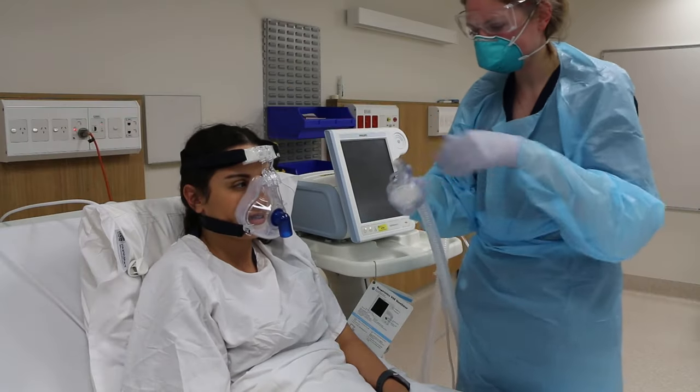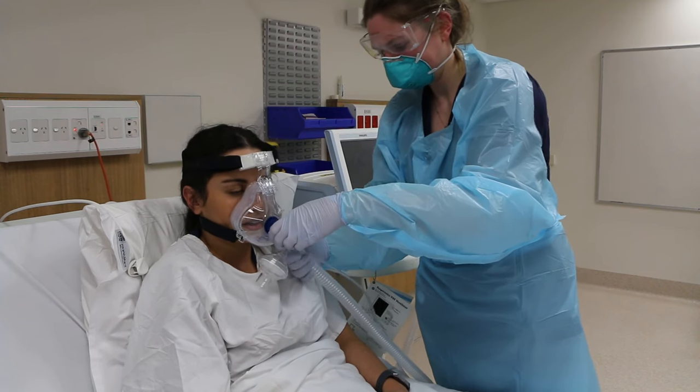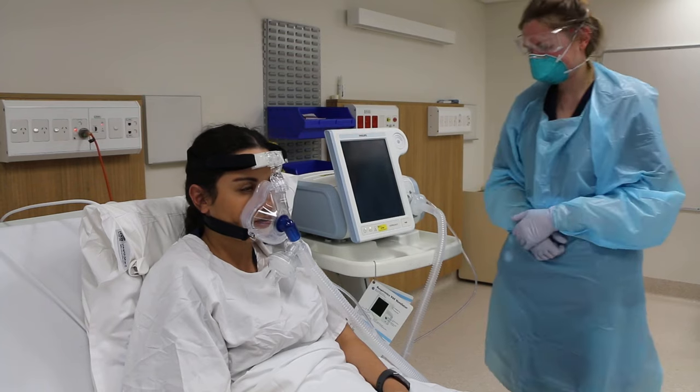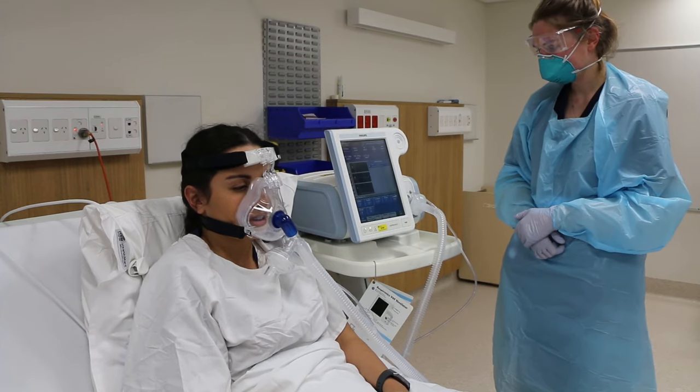Once confident that the mask is well fitted and the circuit is complete, exit standby mode and commence NIV. Remember, do not disconnect the mask from the circuit or remove the mask while the machine is switched on.